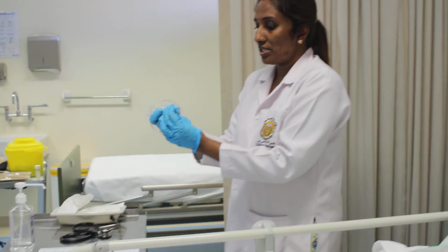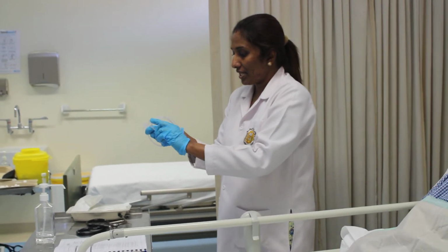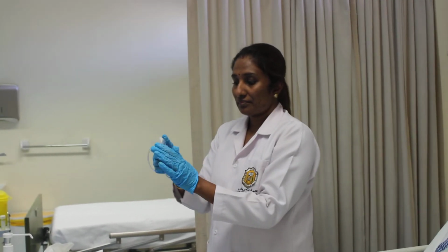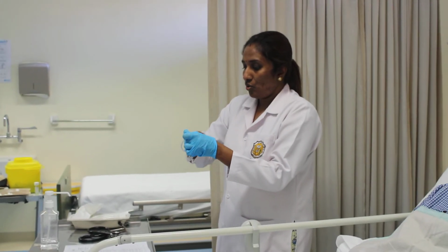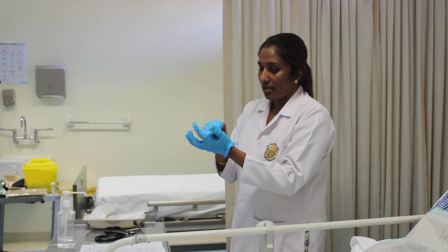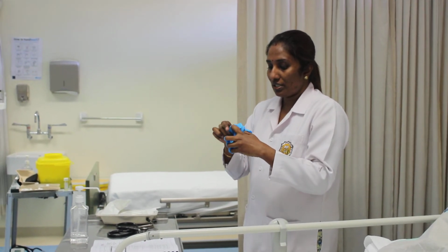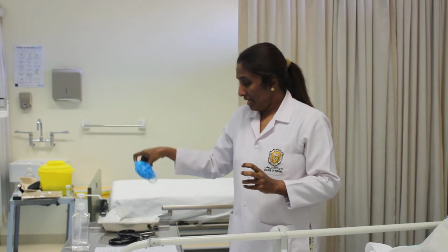And same like all other procedures you have done, you have to remove the safety pin and keep it separately. Keep the tube inside your gloved hand and remove it along with the other glove, so that you are not touching the tube at all, and this will be discarded in the yellow bin.